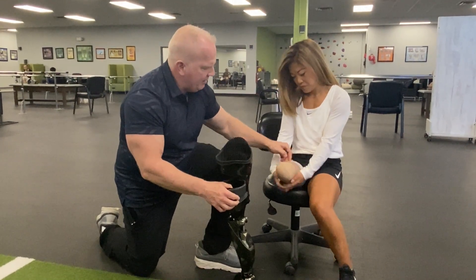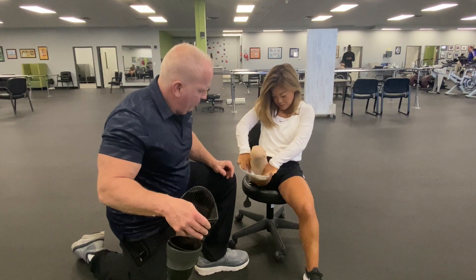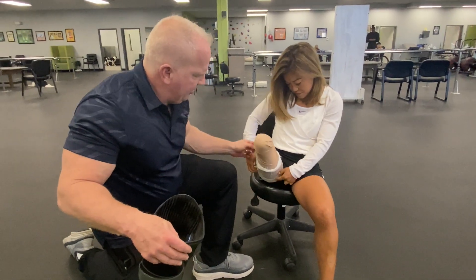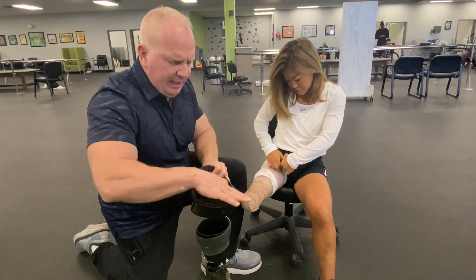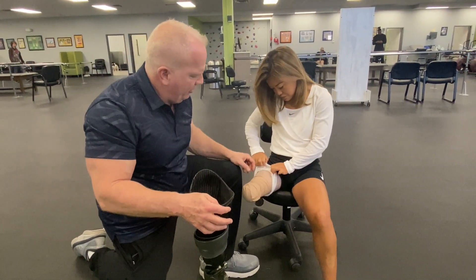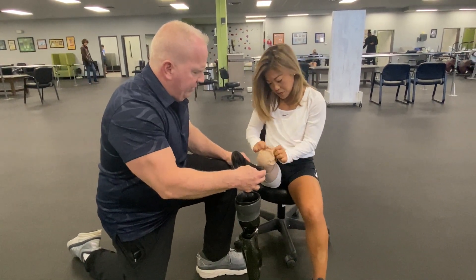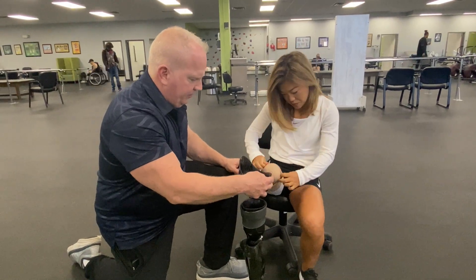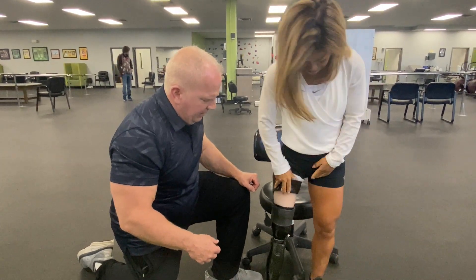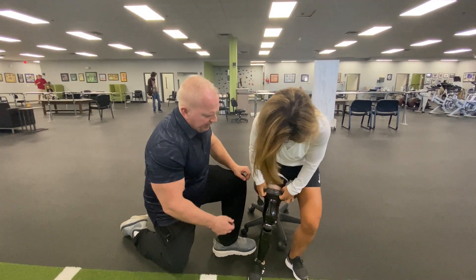The sleeve, once it comes up, makes contact with the liner creating the seal. Once she dons the liner, she has two socks — as you see here they have to split. We're going to take this sock away and line it inside here, so she doesn't even have to wear the upper sock, which avoids causing friction to the liner. Then once we get that set, Scout is able to go into the socket.